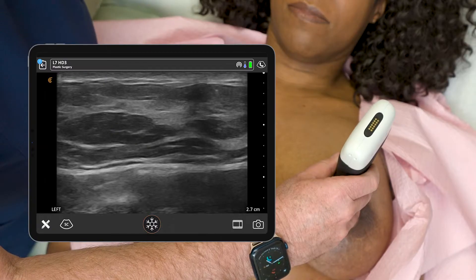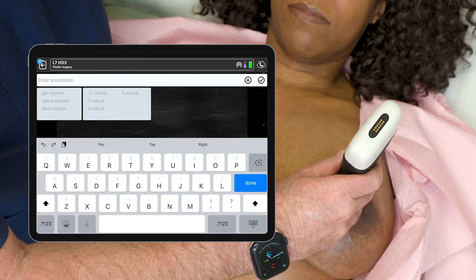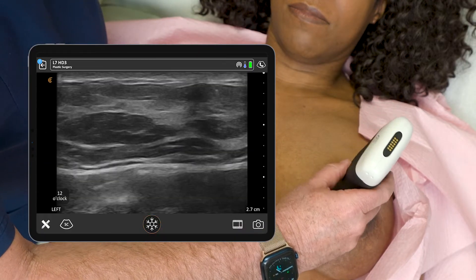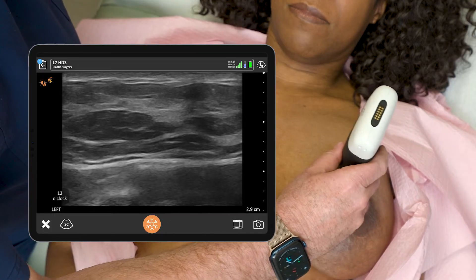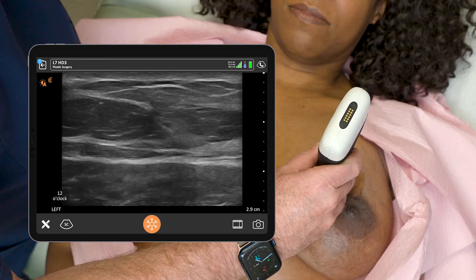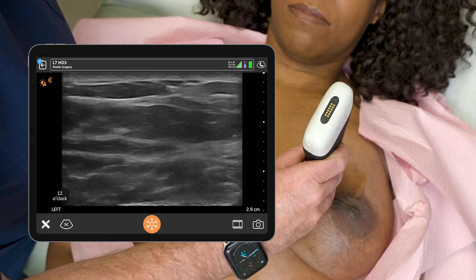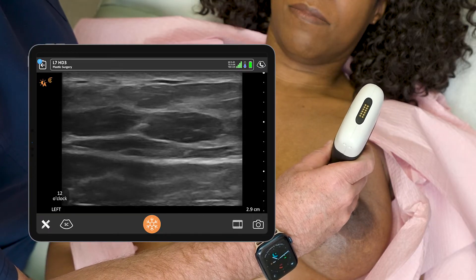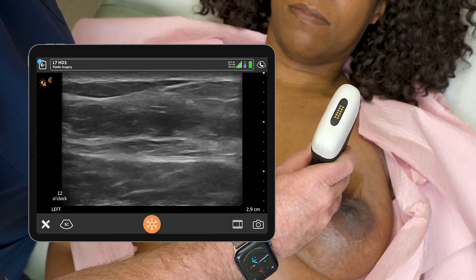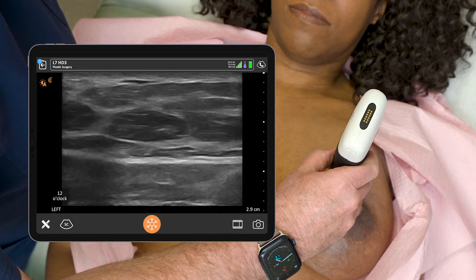We'll go to the opposite side now and start again at 12 o'clock. Now here, this looks drastically different. There are just those two lines of the elastomer shell, and it doesn't have any suggestion of places where it's discontinuous. So this looks more intact on this side.